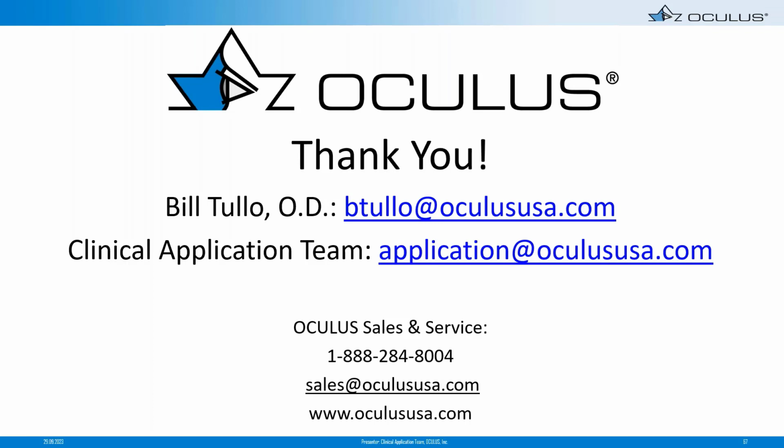So patients with dry eye, one of the benefits of elevation tomography and Pentacam specifically is that it is tear film independent, but patients with dry eye can have a difficult time keeping their eyes open. And even though the Pentacam scan only takes 1 to 2 seconds, depending on what type of scan you're doing, that could be difficult for a patient with significant dry eye to do, especially repeatedly over and over. And maybe the Pentacam wasn't even the first test performed on them, so it can be challenging. So what I find in patients who have a difficult time keeping their eyes open, I will often put a drop of anesthetic in their eye, a drop of proparacaine or tetracaine, and wait a minute or so, and that will usually make the patient comfortable enough where they can now cooperate and do an excellent exam.